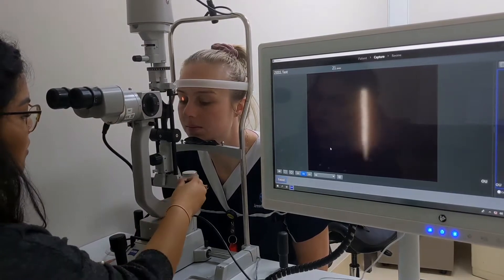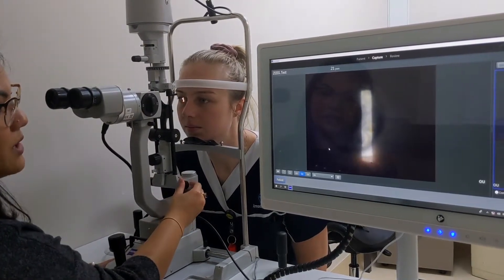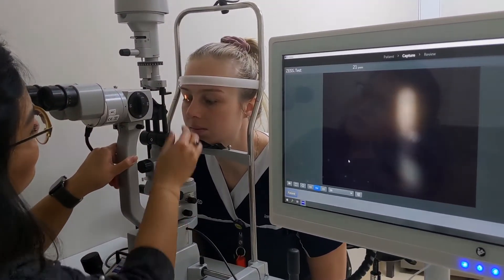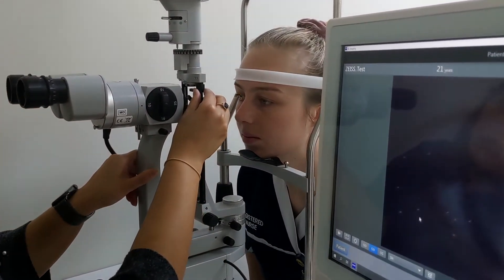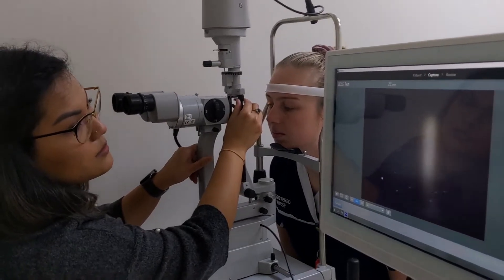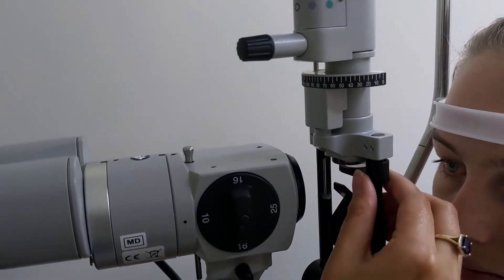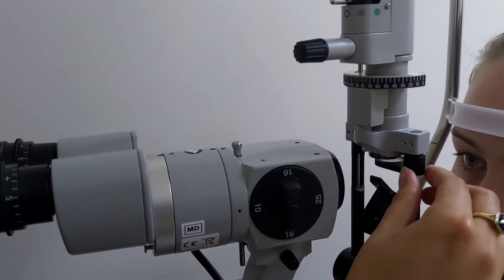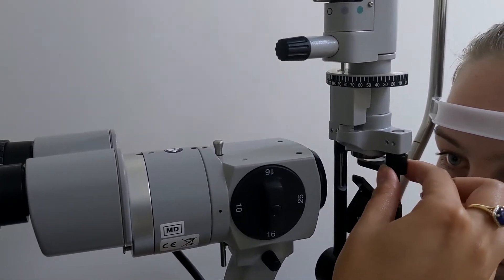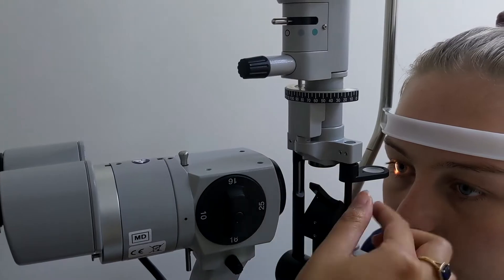I can also change the width of the slit with this little knob here. That's a bit bright on Kelly's eyes — this here is your diffuser, which you can make more diffuse or brighter depending on patient needs. Note: if the diffuser is fully in, you won't see the light as bright. If you think something's broken, just flick it out.